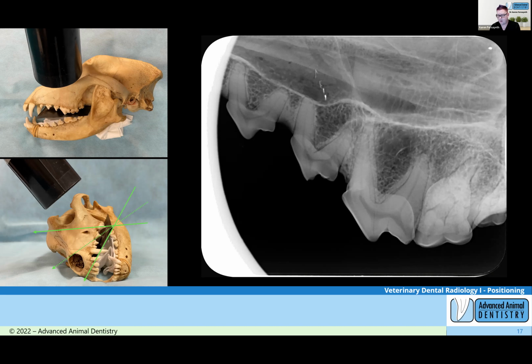But for my mobile machine, I don't have the long collimator, so I'm up a lot closer and using a lot lower levels. I'm seeing around 0.1 to 0.2, but we get similar image quality. So it does just depend on that. Remembering again, like you said, distance squared is important.